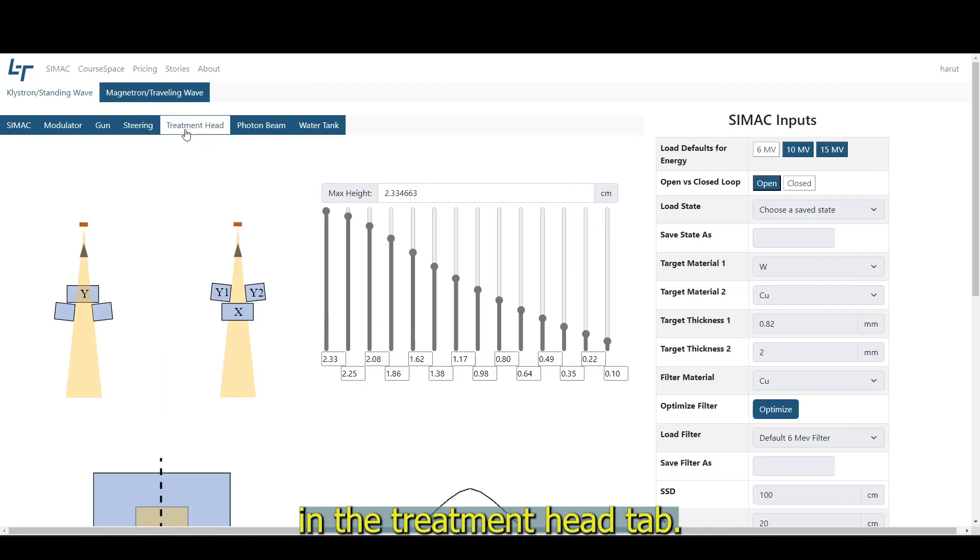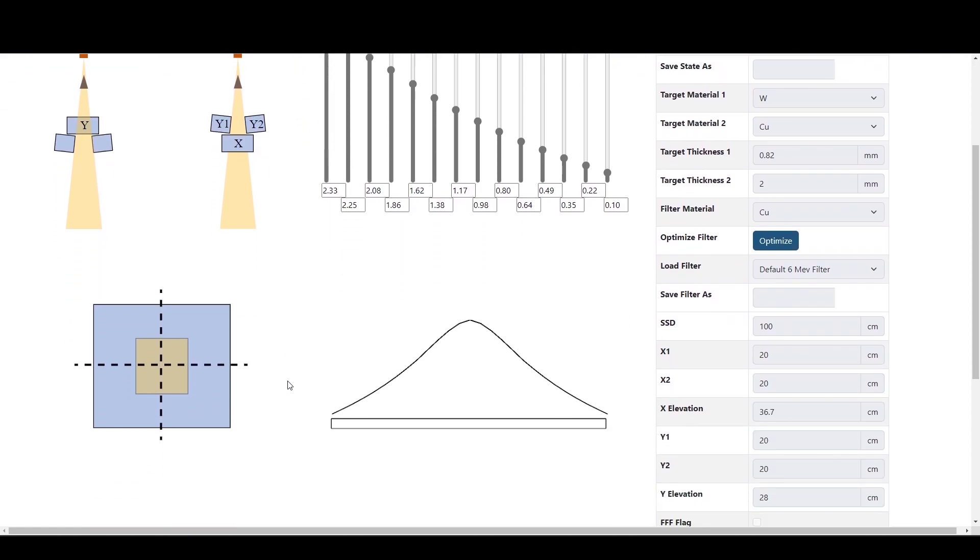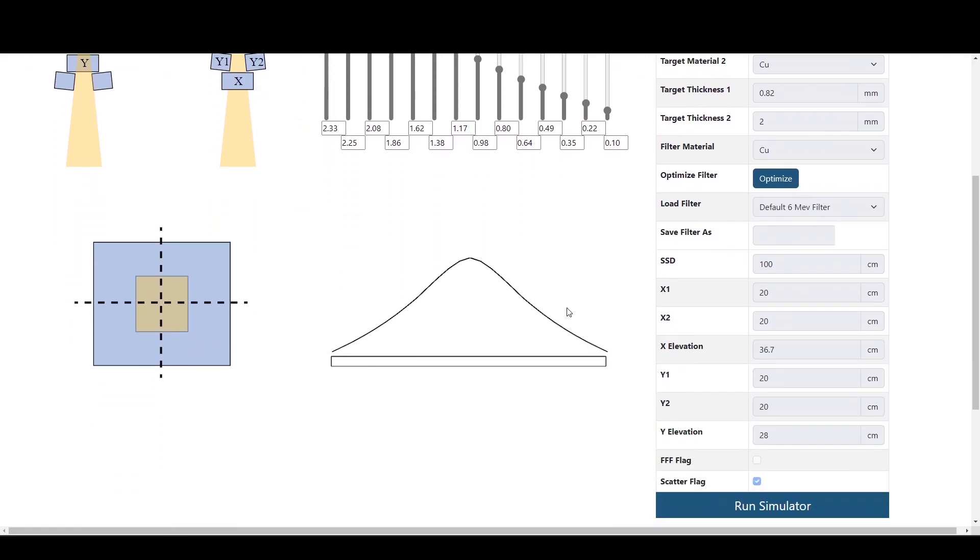In the treatment head tab, we can see the shape of the flattening filter. The field size was set at 40 centimeters.